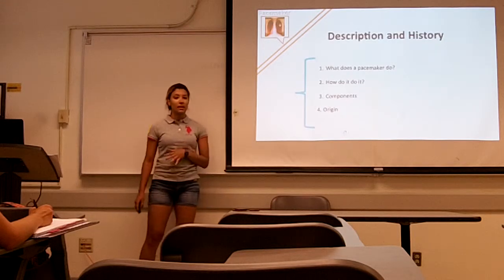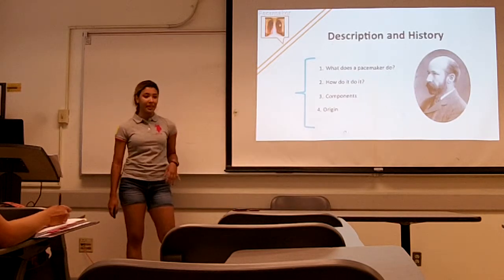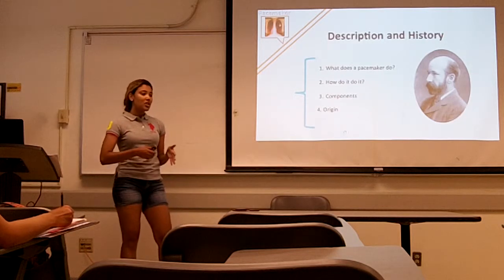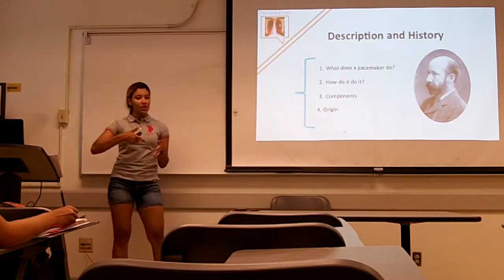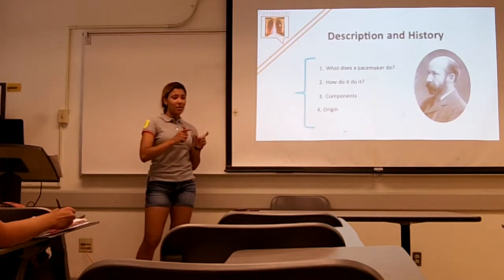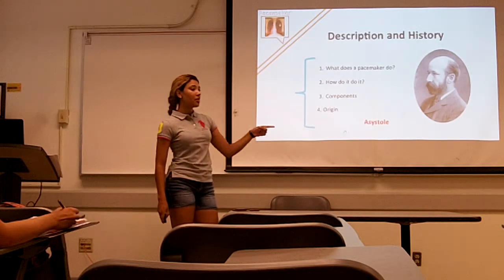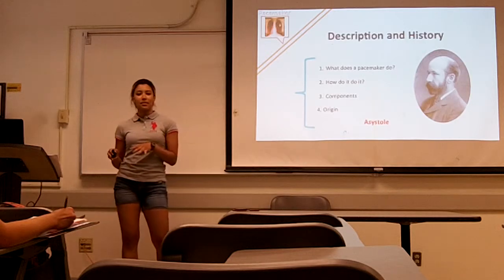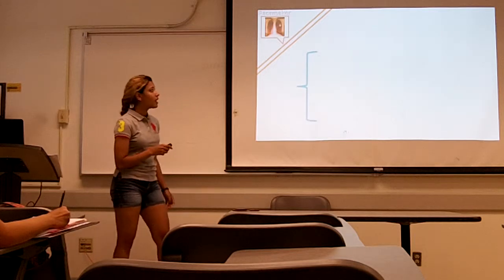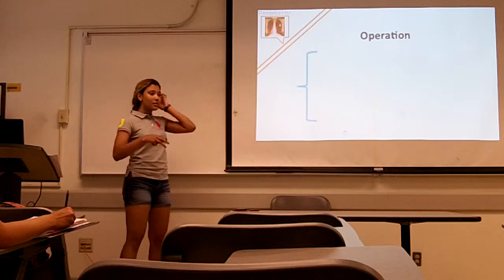It all began in 1899 with this guy called John McWilliam. He reported his experience in which he applied electrical stimulation in the human heart in asystole. Asystole is a medical term for cardiac arrest. It's the same as without beat. Okay. So now let's know more about what a pacemaker is.